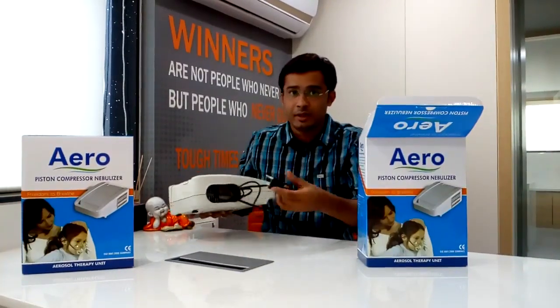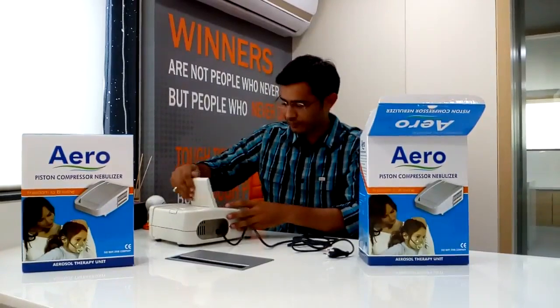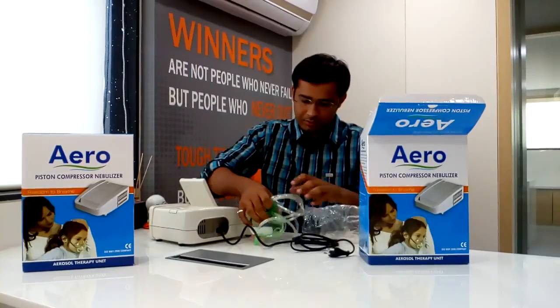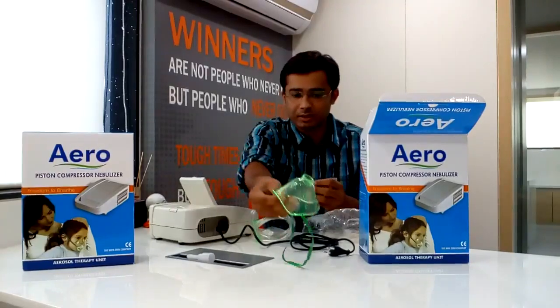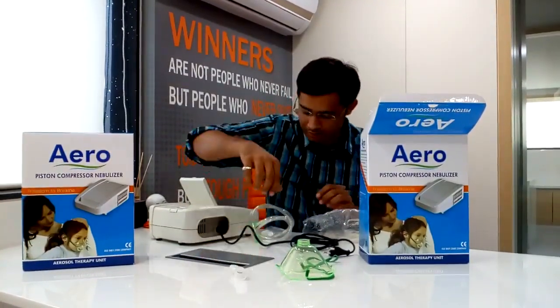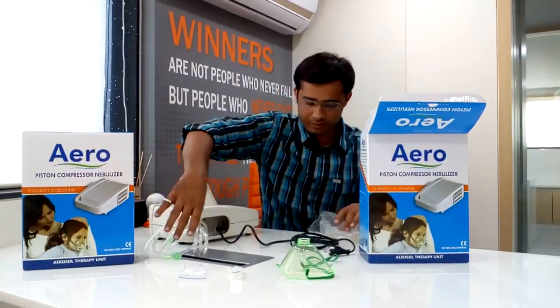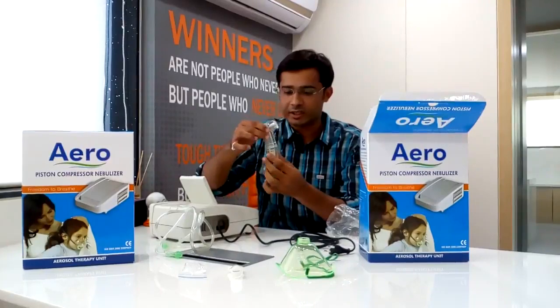Here is the electric cable. It comes with a storage compartment. This is called a mask. This is the mouthpiece, filters, and a tubing. It is a kit.